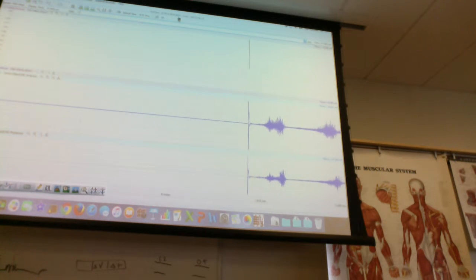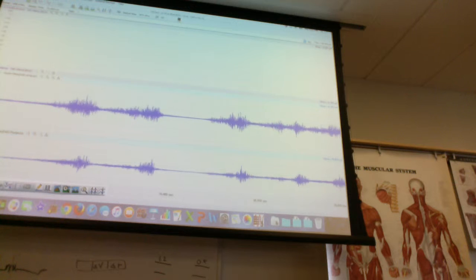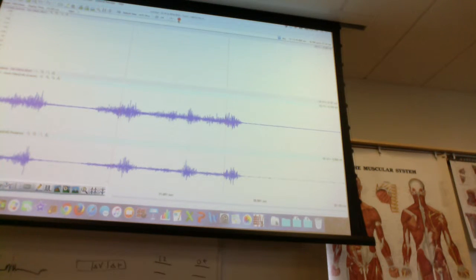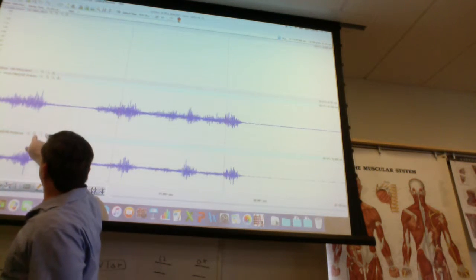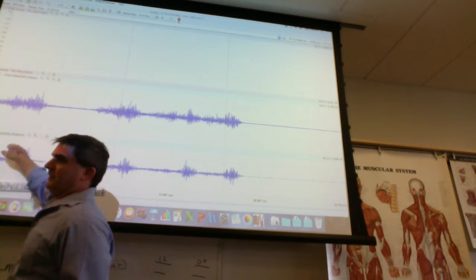Yeah, we can speed this up a little bit. So this is how much this is right here. So you should get something that looks roughly like this. That's a really good one. Now, if you look on the chart here, if your stuff is real small, you can use these. Each one of these has a little thing that says plus and minus, so these can make these bigger or smaller. It's just representing as bigger or smaller. There's one in the middle that will try to do a best fit, try to fill as much of that space as possible.